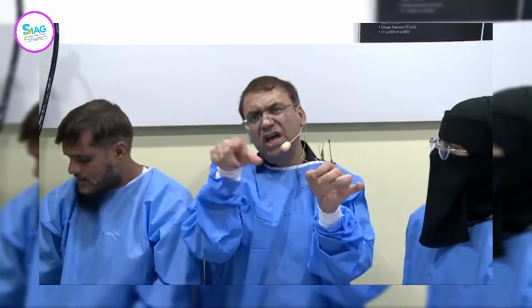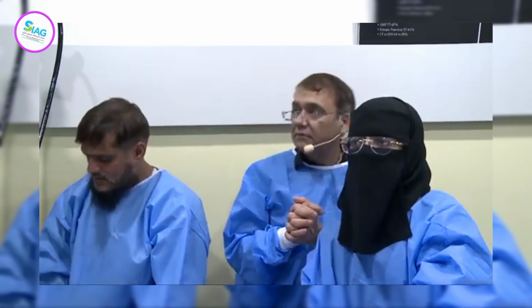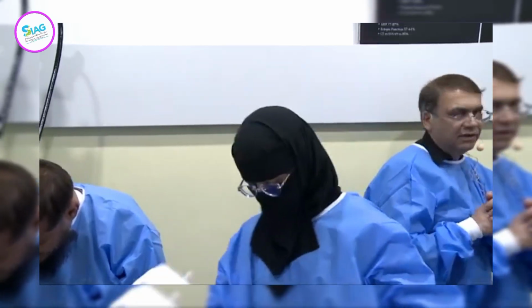You have a nice fluid medium around your probe. The rectal wall is kind of compressed around that. You start pulling back, and what you are looking for is a breakage or a tear in that area, which is going through the wall, and that's the only way. But it's not always really possible, especially if it's really, really small. It may not be a very effective modality, but yes, you can look for that to get an idea where it is. If you have a good MRI facility available, then that's obviously going to give you much better information.